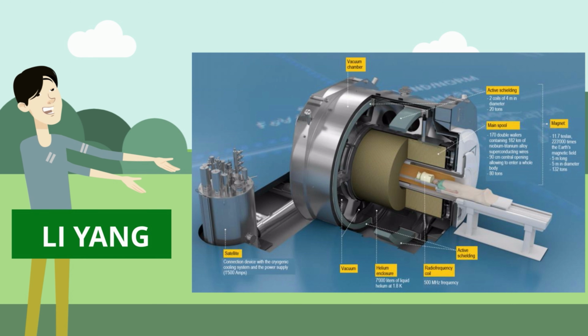Besides, even though superconductive magnets are expensive, the strong magnetic field allows the medical field to acquire high quality imaging, and superconductivity helps make possible the large amount of current that is needed in the coil of the MRI system.